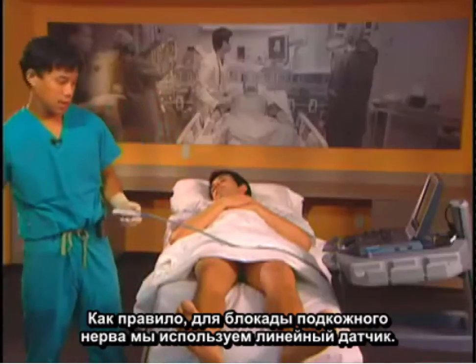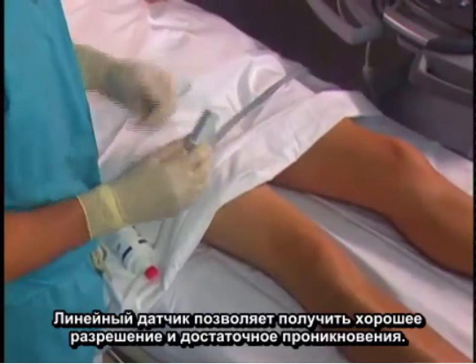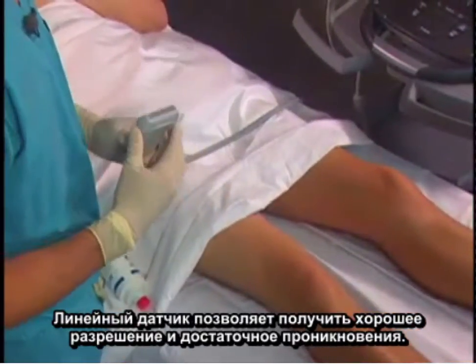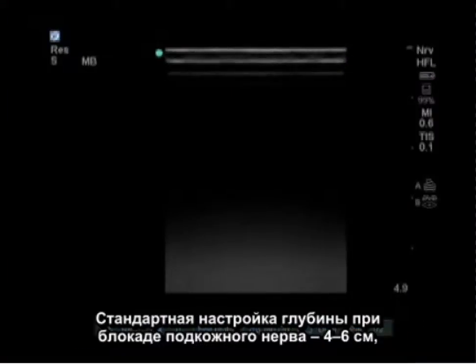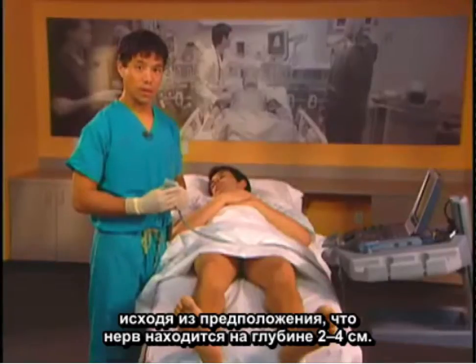To perform the saphenous nerve block, we typically use a linear probe. The linear probe allows us to get good resolution and reasonable penetration. Typical settings start between 4 and 6 cm total depth, expecting the nerve to be between 2 and 4 cm.